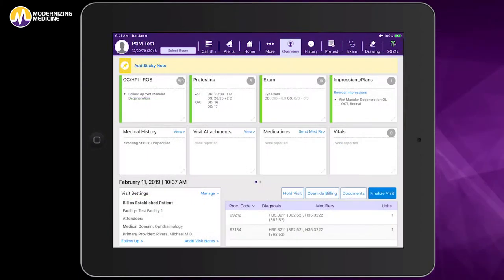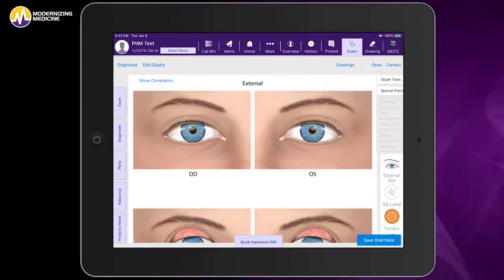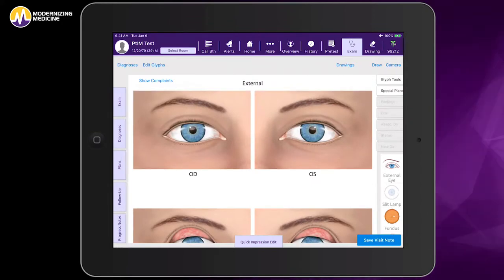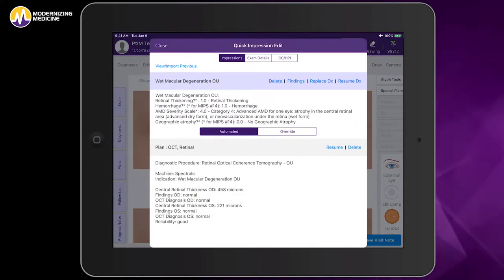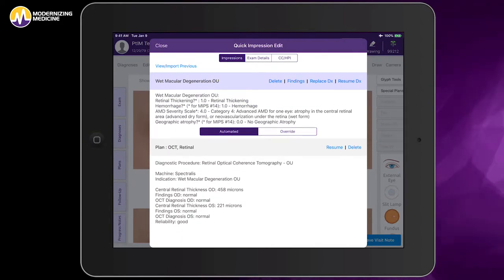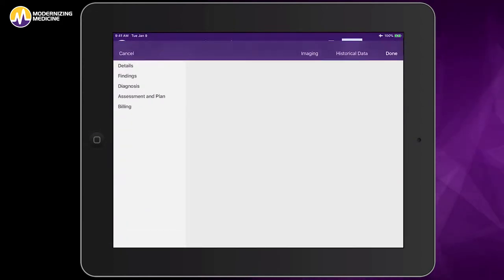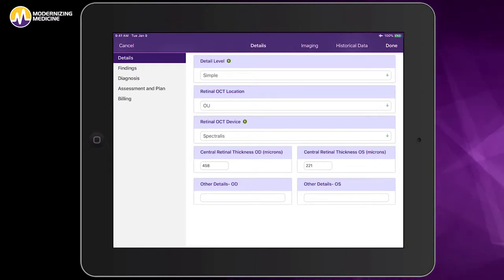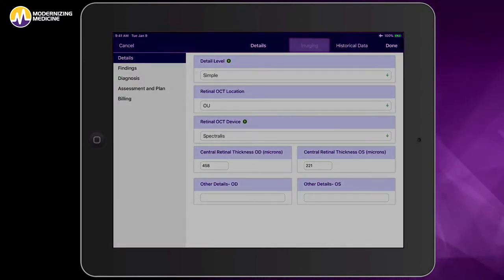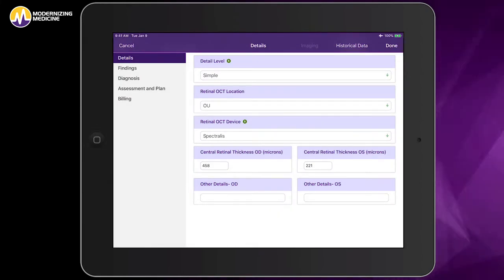Let's begin within the patient's chart in EMMA. From here, I'll enter the exam room where I've already documented that this patient has macular degeneration. Now I want to open, review, and document the OCT findings. I do so by clicking on imaging to open the image management system.